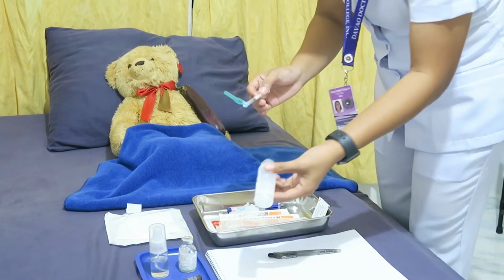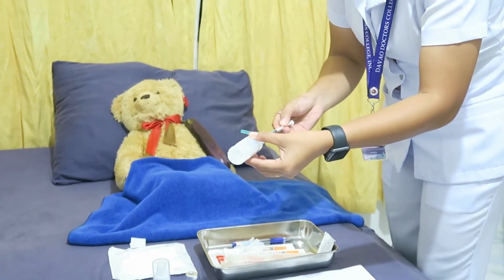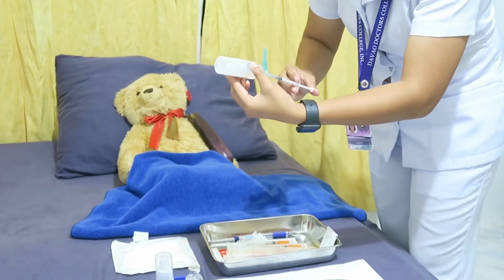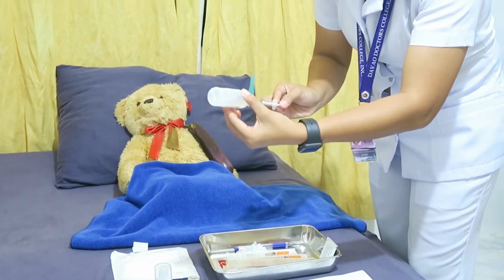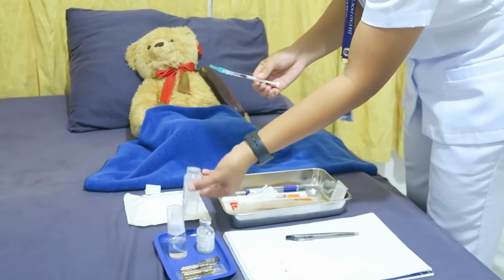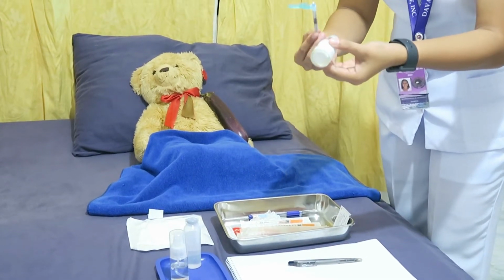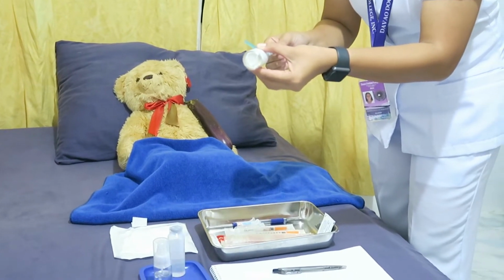So this is the vial. Let's insert the needle. As you can see, the air is here, so let's insert it into the vial. Remember, insert it into the center of the vial.